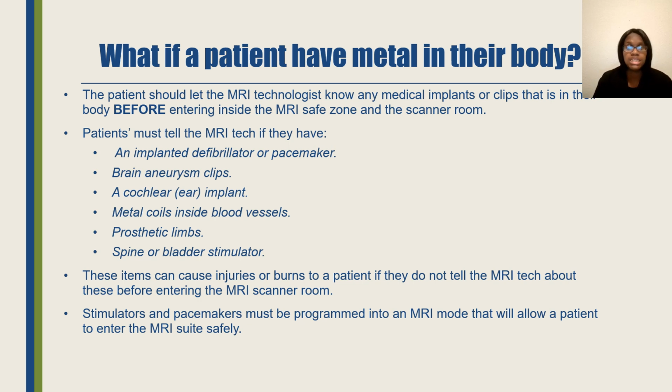All right, so if a patient does have some type of metal or implants in their body, we have to verify. We have to make sure that it's MRI conditional to go inside the room, meaning it meets certain conditions, if it's not MRI safe.